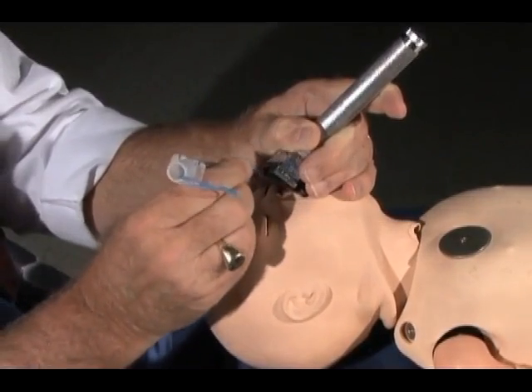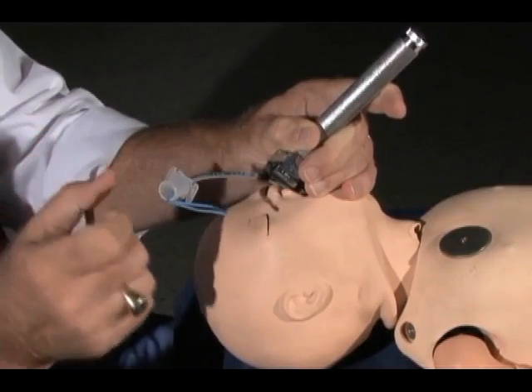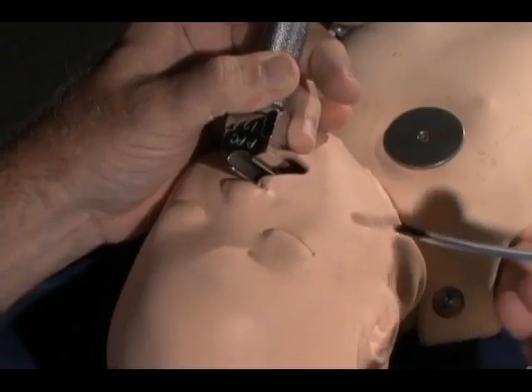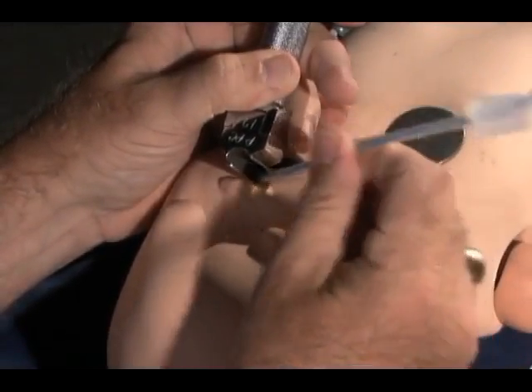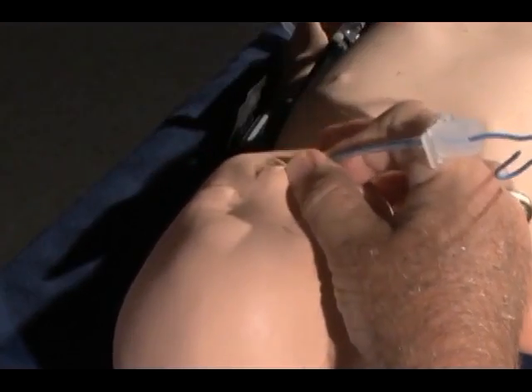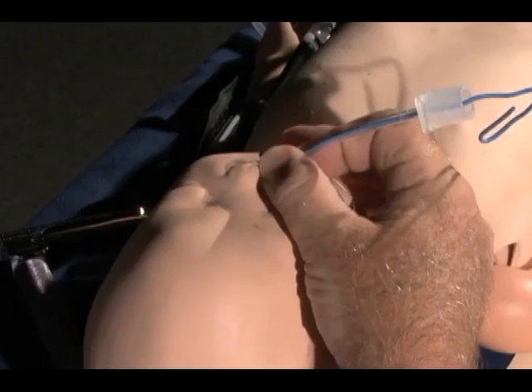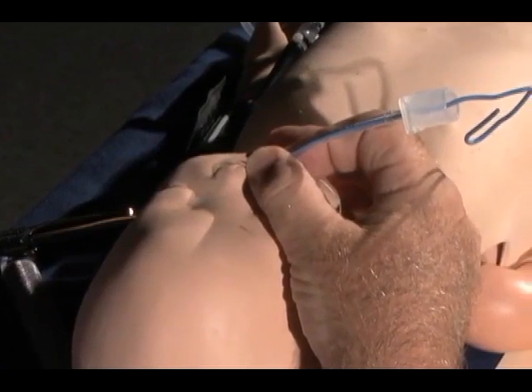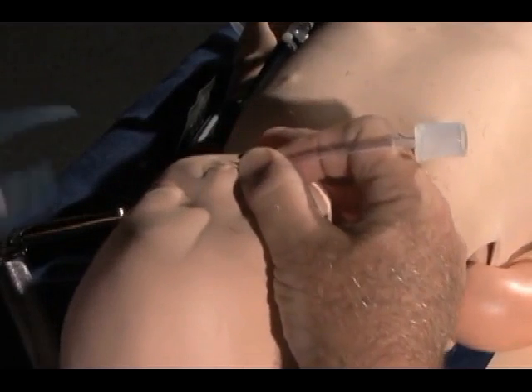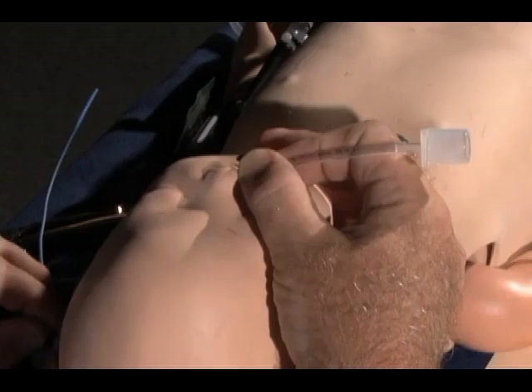For this reason, in children we enter from the side with the tube molded into a slight curvature, as demonstrated in this sequence. Notice the mild curvature of the tube and the insertion entering at a perpendicular angle from the side, permitting visualization of the glottic opening the entire time. Also notice how the thumb of the right hand naturally hits the maxilla, which is the fixed or stationary bone, versus the mandible which is mobile.